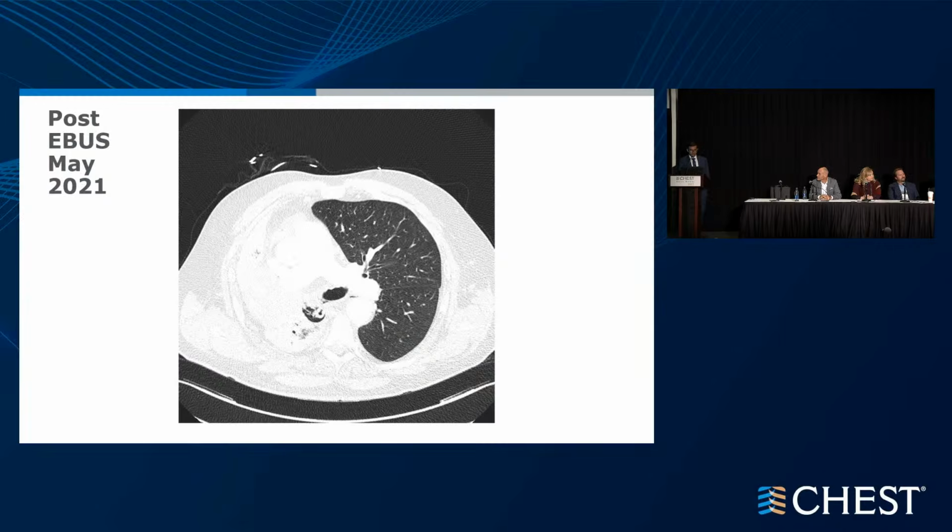I guess I'll step back and say, what would you do next? Right, so it sounds like he had a prior bronchoscopy, and it said there was concern for malignancy. Tell me more about that. Yeah, so we had our cytotech, and she said, this looks like malignant cells. And so this was all in one setting. The patient came in for a bronchoscopy, and then got tissue biopsies, and post-procedure was just struggling with dyspnea and had escalating oxygen requirements, all in the same setting.